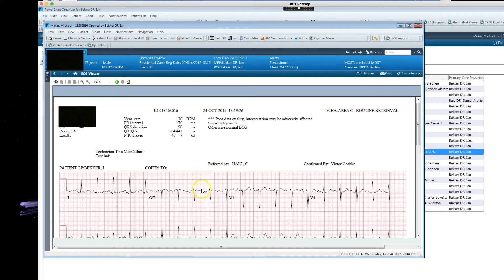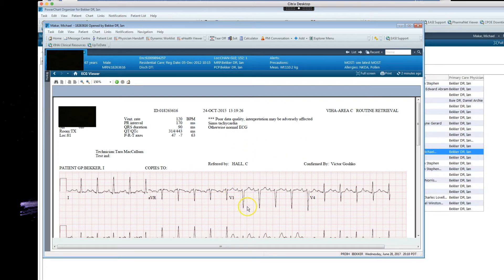And there you are in beautiful full Technicolor with all the details you'd ever need and the interpretation. And to get back home, just hit the house.